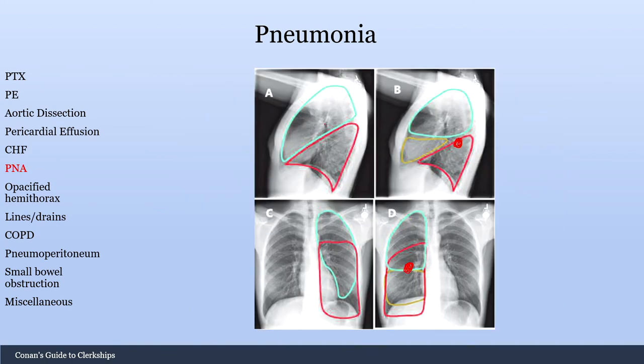This is really important because on the left lung, a density all the way down could be in the lingula or the inferior part of the upper lobe — not necessarily a lower lobe pneumonia. A density could be a lower lobe or an upper lobe pneumonia. You need that lateral X-ray to figure out where the pneumonia truly is.